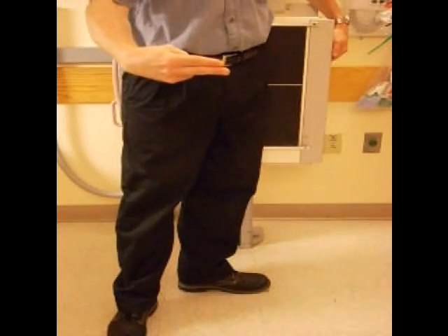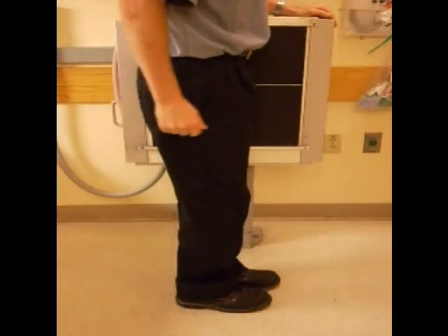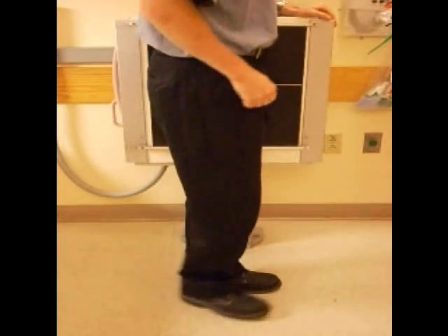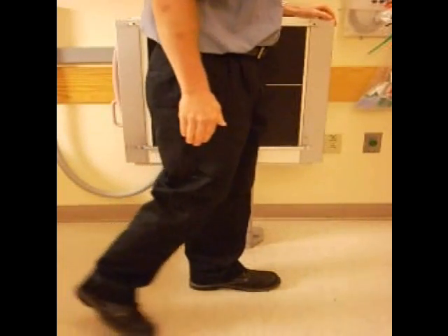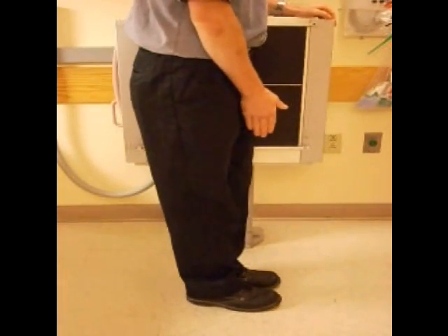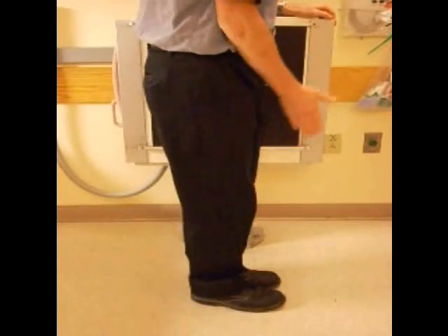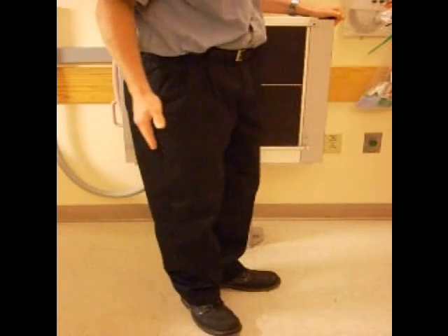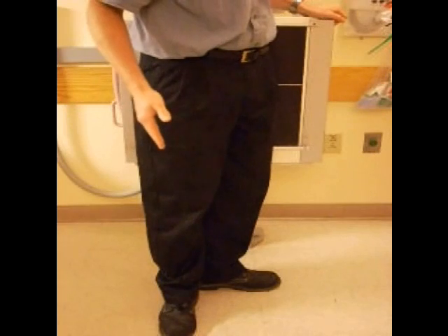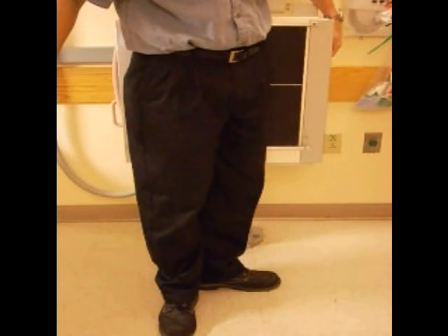The second variation for the left side is to start the patient in this position once again. This leg straight up and down with the patient's weight on it. The affected leg foot should be parallel with the film. The unaffected leg will be perpendicular, as such, and the pelvis will form approximately 65 degrees.